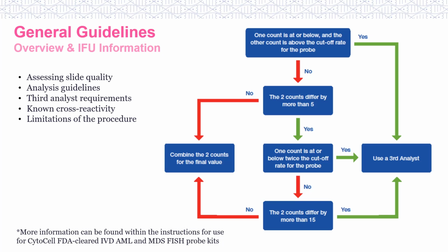Lastly, before interpreting results, any known probe cross-reactivities or limitations of the procedure should be taken into account. CytoCell includes probe cross-reactivities in both our IFUs and package inserts. Limitations and contraindications of the probe's use will only be found in our IFUs for our FDA-cleared probe kits.